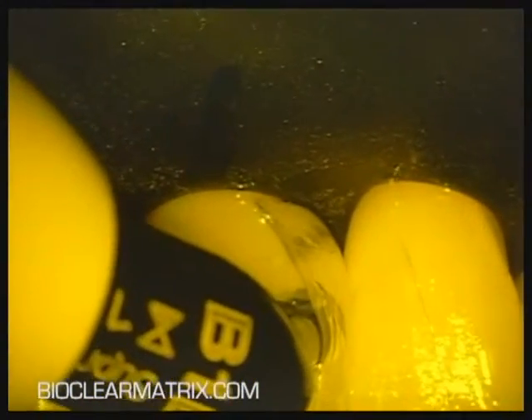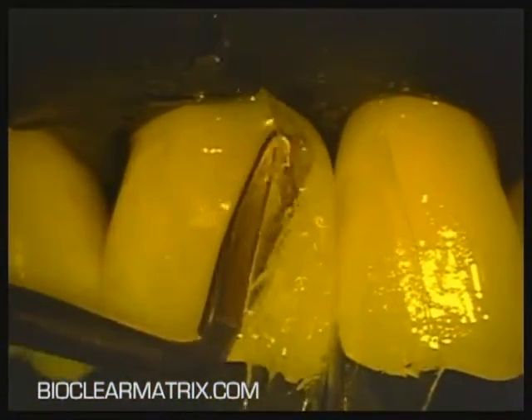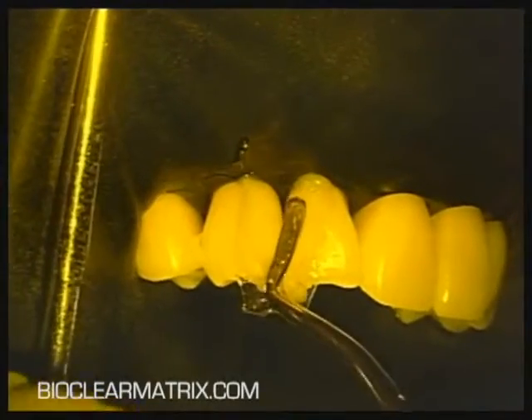When bonding to etched enamel with the injection molding technique, there is no need to cure the bonding resin before placing the composite. When performing injection molding, the bonding resin, flowable, and paste composites are cured altogether instead of curing them individually.